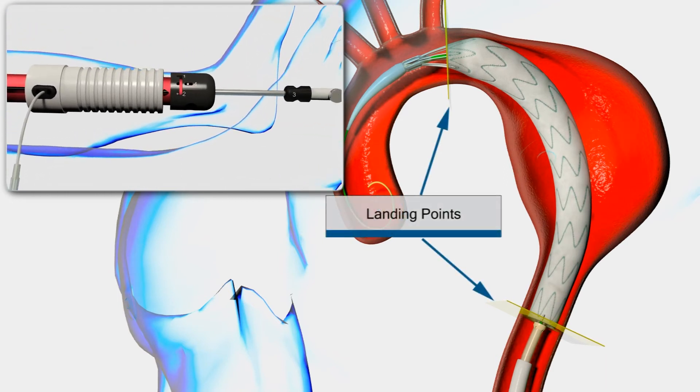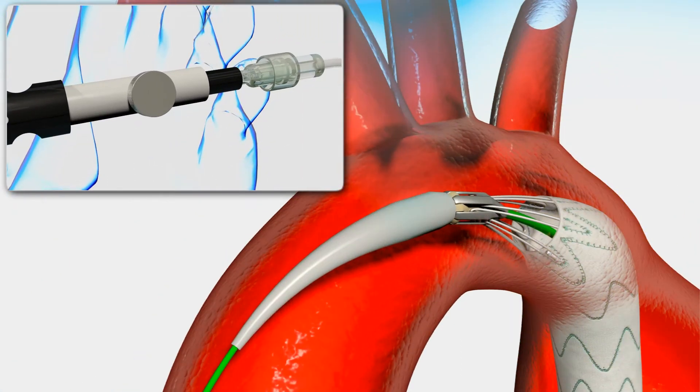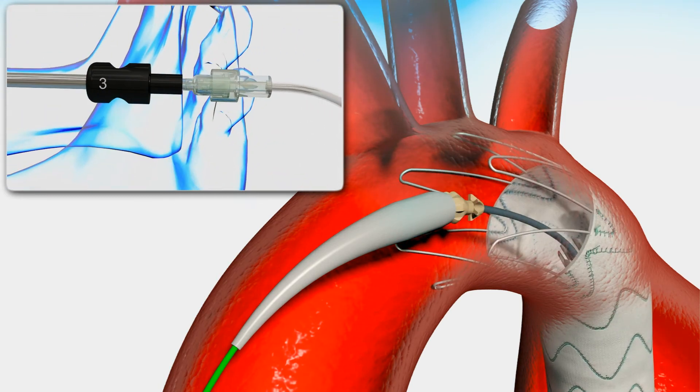At this point, the stent graft is fully deployed and the bare metal stent is still attached to the delivery system. Remove the apex release retainer by loosening the thumb screw. Release the bare stent by pulling the apex release grip marked number 3 completely towards the guide wire lure.